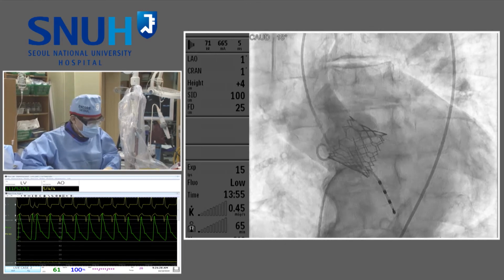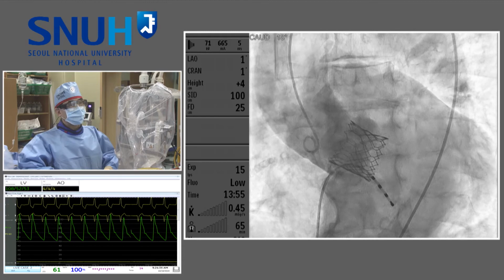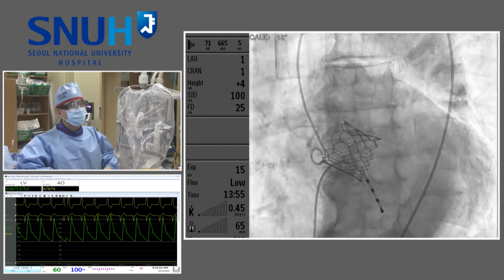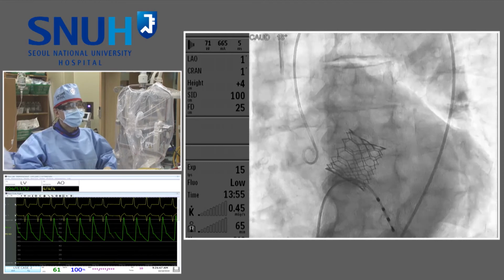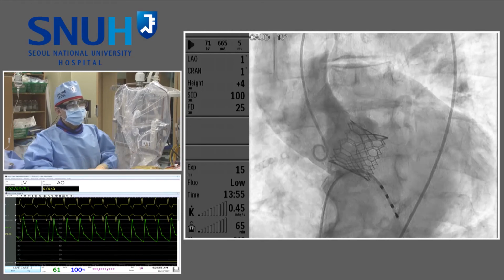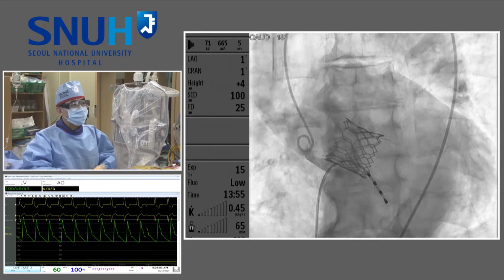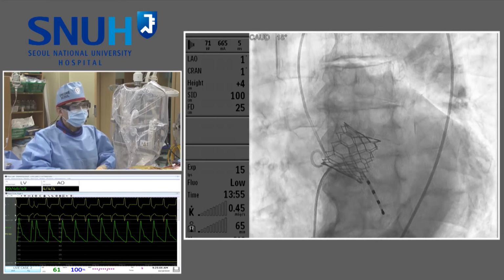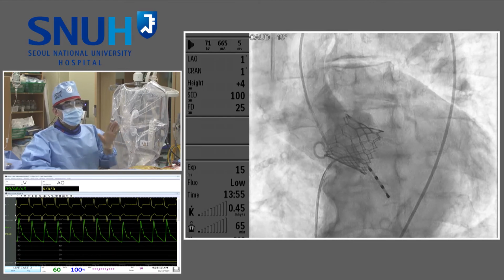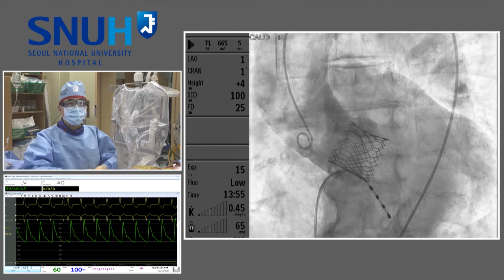You're not going to be greedy, right? So, Dr. Kim, one very last question. Because the patient has renal insufficiency, wouldn't it be adequate, if you're very happy with the echo, to leave the angio alone and not overload with more contrast? It's a good point. Usually we do not do aggressive angiography. For this live case, we performed angio more aggressively. Then we always have a plan to remove the dye as soon as possible after the procedure. Before the procedure, there is a limitation of volume overload. Thus, in such a TAVI case, we are always very aggressive, including CRRT, to remove the dye to protect the kidney.